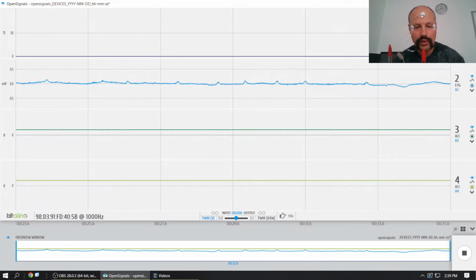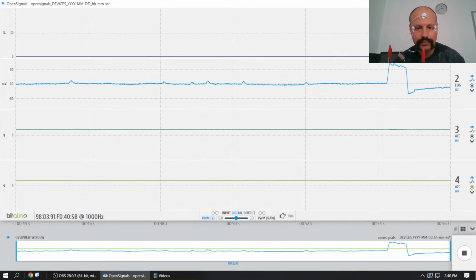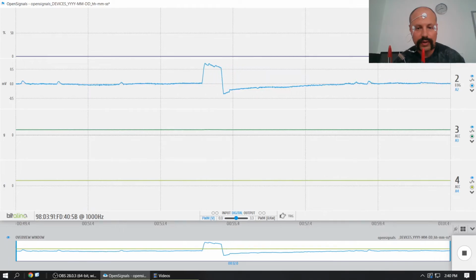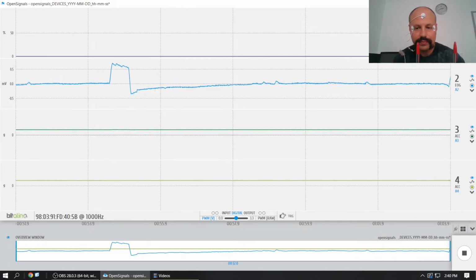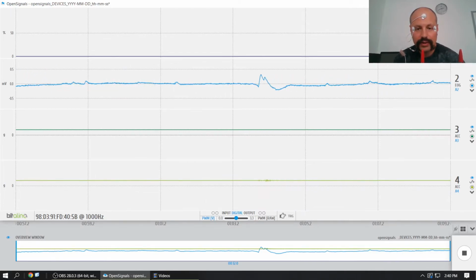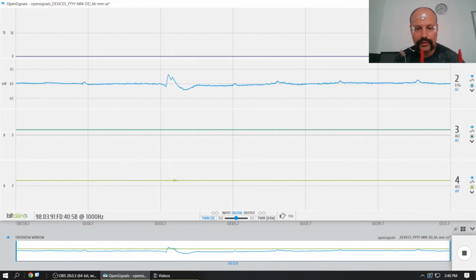So, those two objects I place in front of me to better identify the fixations. Now the gaze is fixated on the center, and then I rapidly saccade to the right and back. And you see a beautiful deflection in the positive polarity.